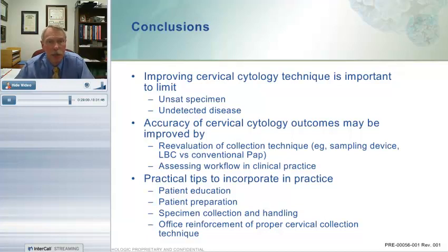Second question. Had a patient with an ASCUS Pap smear and reflexed HPV. HPV came back unsatisfactory. Why? The most frequent cause of unsatisfactory human papillomavirus screen is that your original Pap smear did not have enough cellular material to be able to do both the Pap smear and the HPV screen. Frequently, and particularly with the ASCUS patient, that may be a factor in the patient's management, so that you would want her to come back for another attempt at obtaining the high-risk human papillomavirus screen.